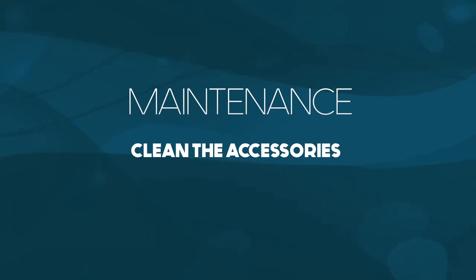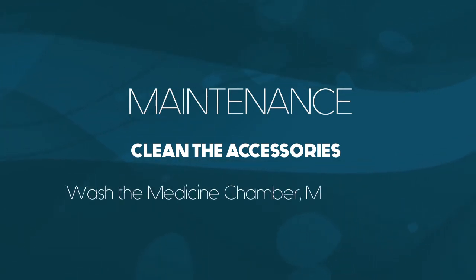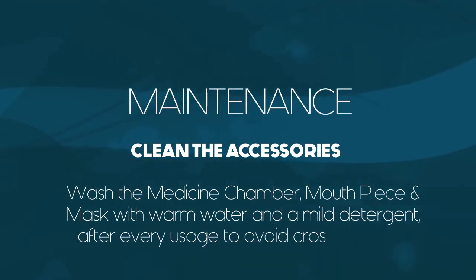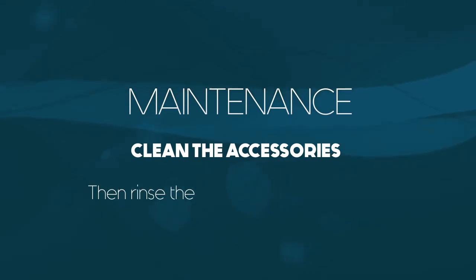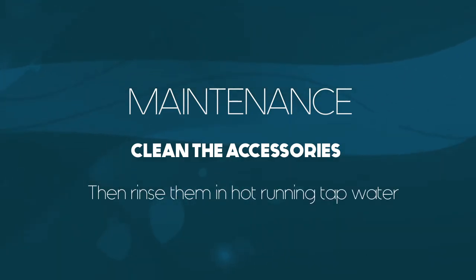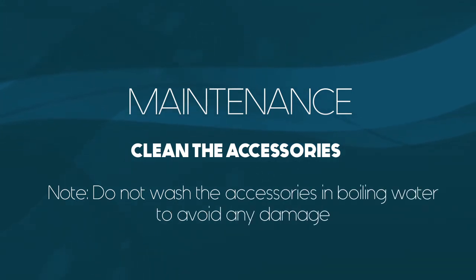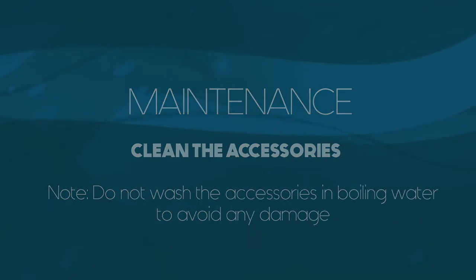Clean the accessories. Wash the medicine chamber, mouthpiece and mask with warm water and a mild detergent after every usage to avoid cross infections. Then rinse them in hot running tap water. Note: do not wash the accessories in boiling water to avoid any damage.